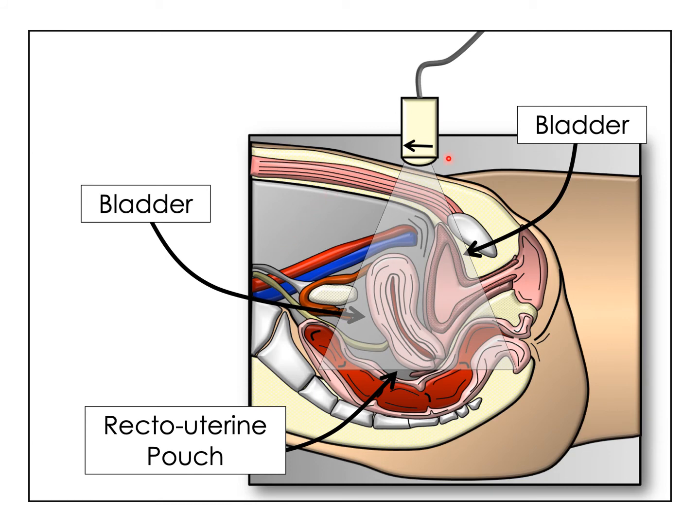Move on now to the female anatomy. So the same basic principle, all the spaces that you want to see are behind the bony rim of the pelvis, the pubic symphysis. So you slide the probe down until it hits the pubic symphysis, and then you fan or rock down into the pelvis. With the uterus behind it, you now have the pouch of Douglas, or the space behind the uterus for fluid to accumulate. It's important to know that, like the liver tip and the inferior pole of the kidney, fluid can really accumulate anywhere here around the uterus, between the uterus and the bladder. There's extra spaces for fluid.